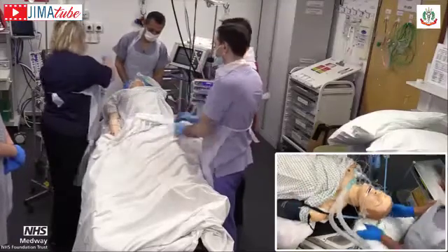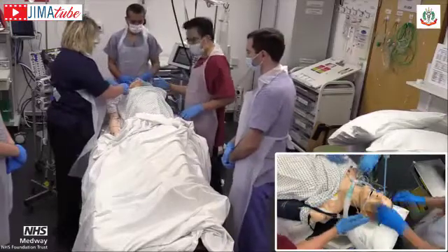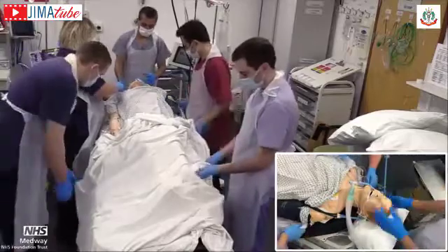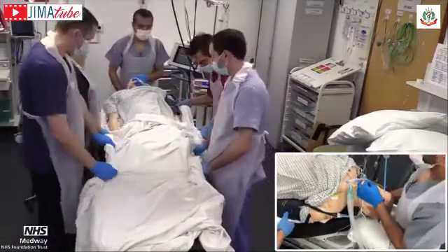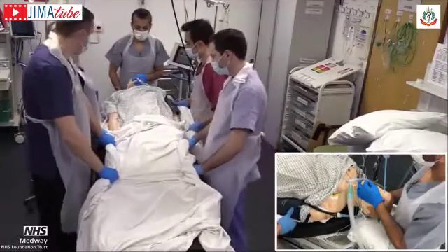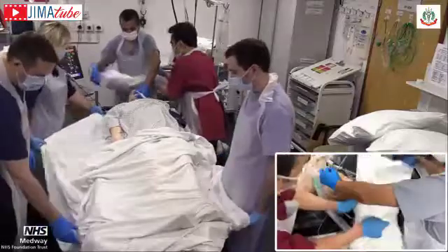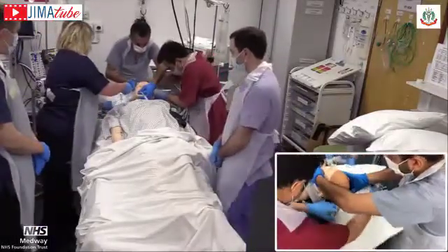Okay, are you happy, Vipul, with your head position? Yes, I am. His head is slightly on the outside of the mattress, so we can slide him downwards. Sliding downwards. Okay, 1, 2, and down. If you tell me when, I will insert the pillow underneath.